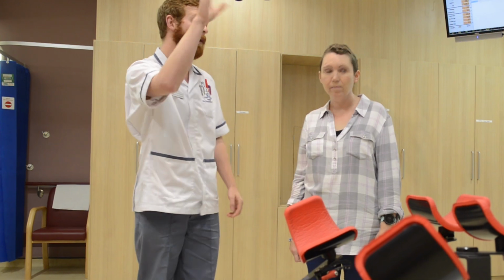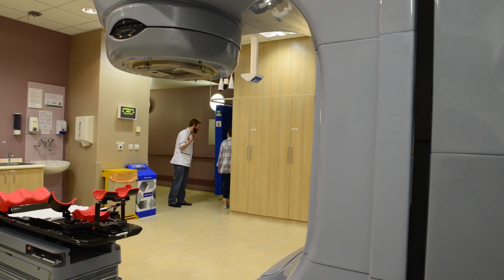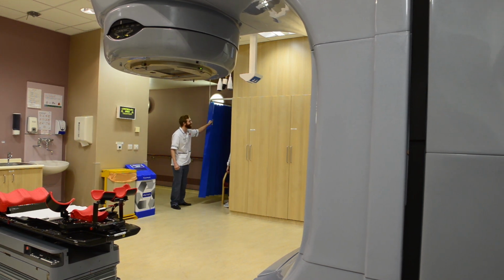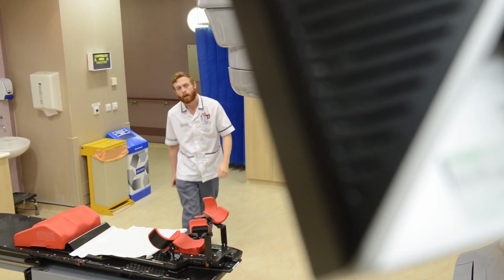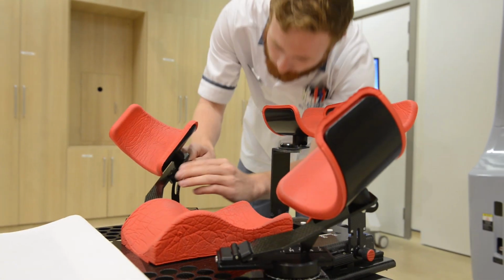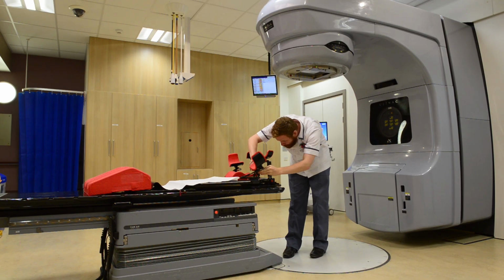Within our treatment area, you do have a side area where you can sit and you can get changed. There's a curtain you can draw. And again, we can provide you with a piece of paper to cover your chest. My advice would be to wear something that's very comfortable and easy to get on and off. You are naked from the mid up, but your dignity is there the whole time. You can have a piece of paper that covers you to get you to the machine, and when you get off the machine as well. So it's all very private, it's all very confidential.